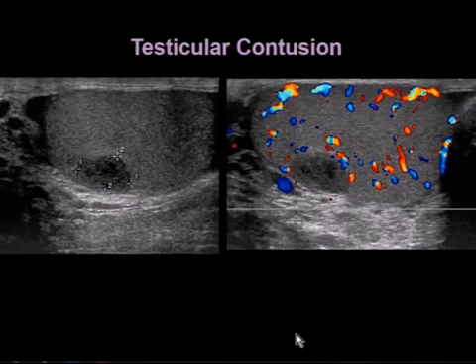This patient has a testicular contusion. Contusions can look like intratesticular masses and can raise concern for malignancy. Here we have the well-defined lesion that's hypoechoic and heterogeneous. And because of the fact that it can be confused, this may sometimes come to resection.